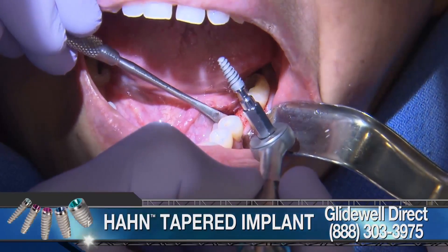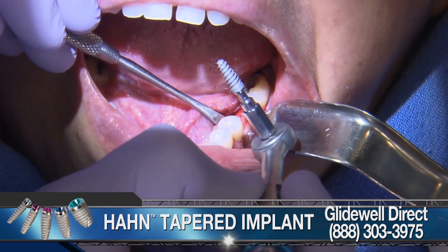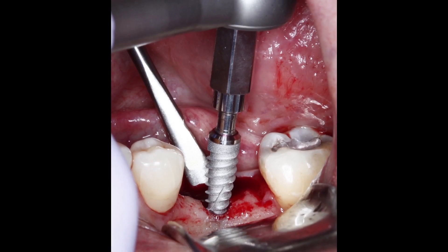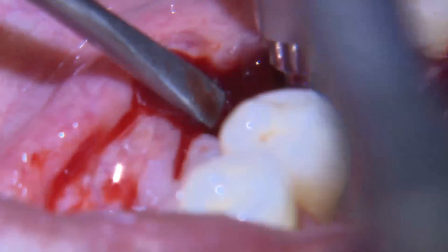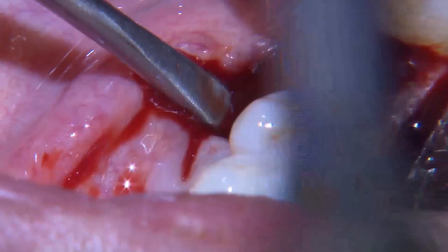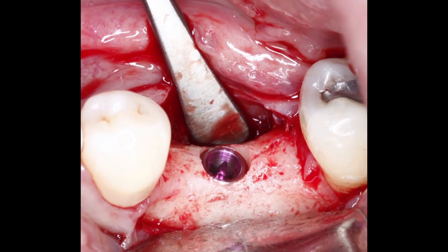Once I've finished the osteotomy with the final shaping drill, I'll go ahead and place the implant. You have the option of placing the implant with the torque wrench or you can use the surgical handpiece, but you don't want to use the same RPM as you used creating the osteotomy. You want to drop the RPM down to 25 to 30 so that you have a lot more control with placing the implant.